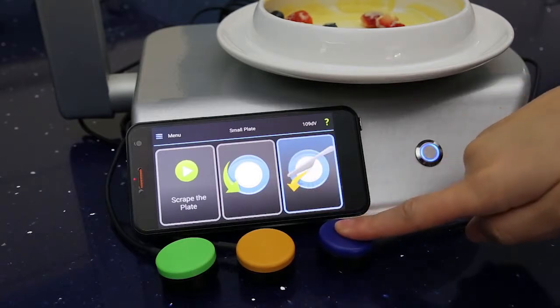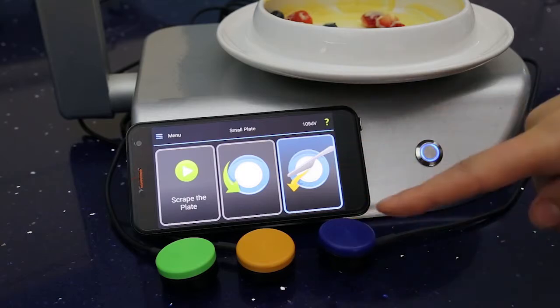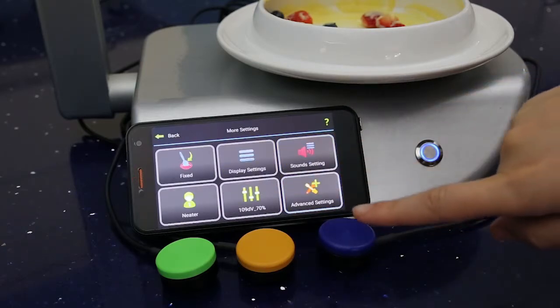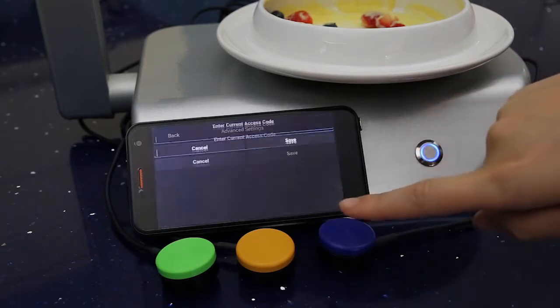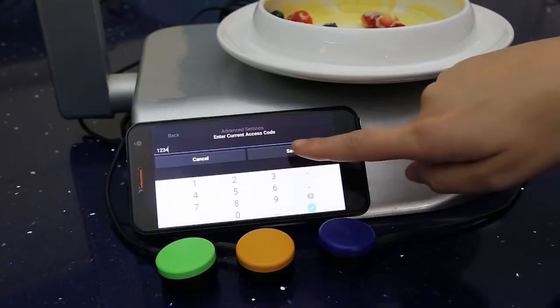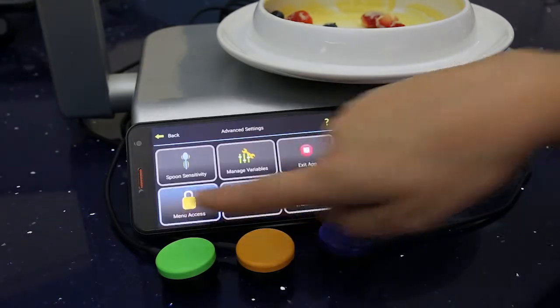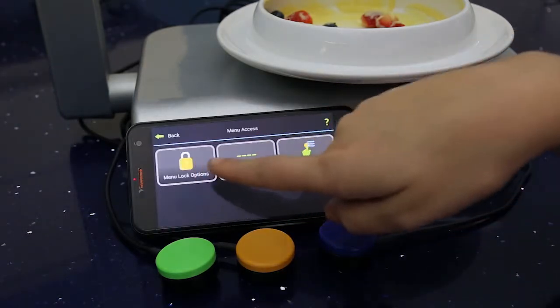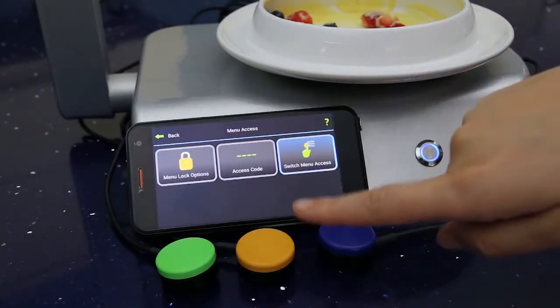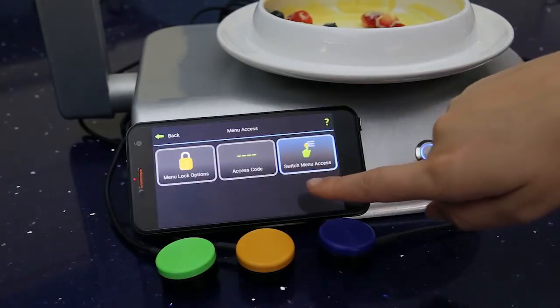If you press and hold it, you get plate scrape. If you want to access the menu using external switches, you need to set this up by going into More Settings, Advanced Settings, then enter the access code. 1234 is the default. Click Save, and then Menu Access. Click Switch Menu Access, yes. And then you click back.